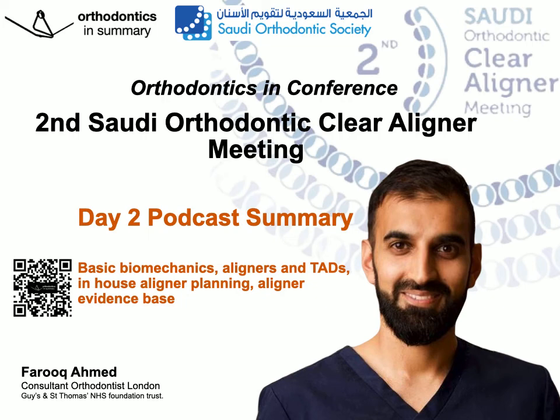He went on to describe intrusive movements, and he described proclination of teeth being the main component of this. And as a thinking orthodontist that Key clearly is, he looked at, well, how do we achieve a true intrusive movement? And what he found was that by placing a lingual attachment, we don't quite create enough counter moment to stop this proclination. Actually, what we need to do is purposefully retrocline the incisor whilst we're doing an intrusive movement, essentially creating that counter moment.